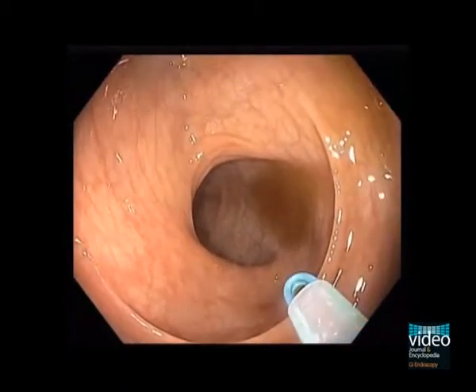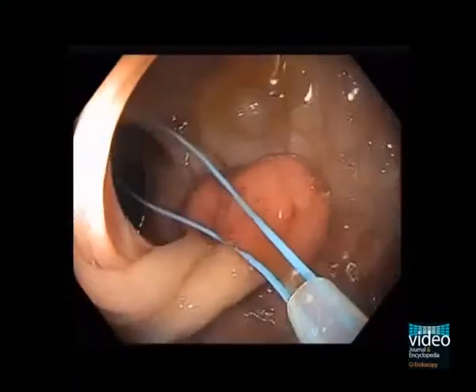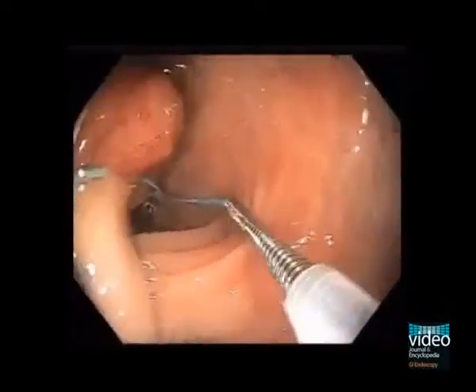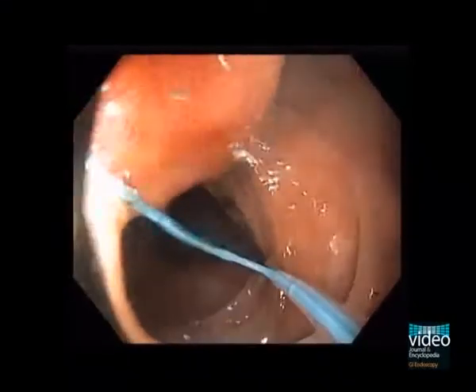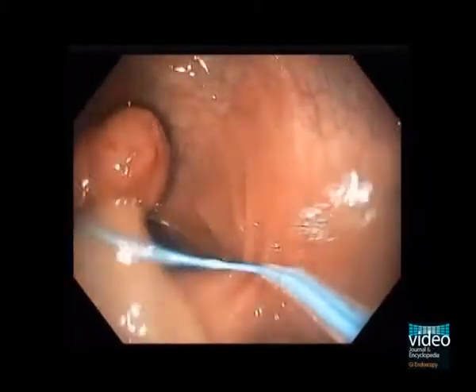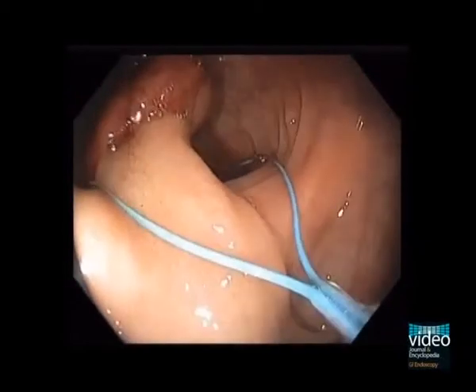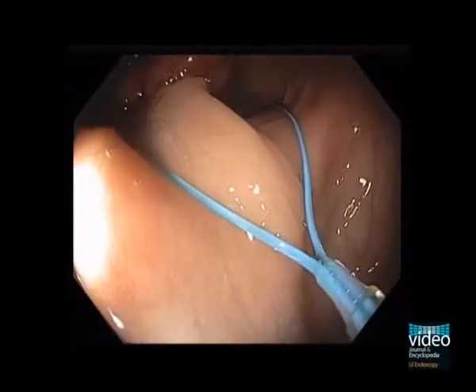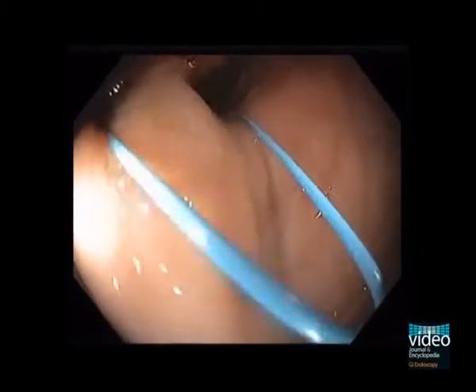To prevent bleeding, we apply a loop ligating device like an Enderloop that acts as a tourniquet. The Enderloop is opened and negotiated around the polyp and brought down to the pedicle, then positioned on the stalk some distance away from the lower edge of the polyp.